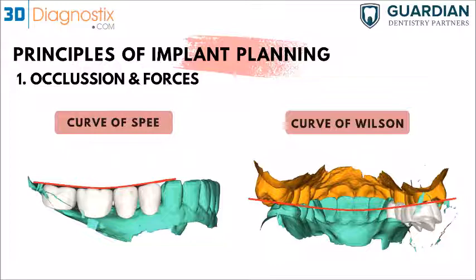So we're going to go through this together. We're going to be adjusting or having the wax-up done in an online session where we share our screens with you. And if we have any concerns, any comments, of course, we'd let you know then, so we can decide what we can do and how to work around the concern.